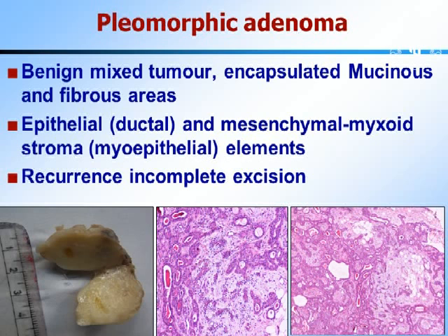So how do we diagnose a pleomorphic adenoma? The diagnosis starts at the grossing table. You can make out that they are pretty well circumscribed lesions and they've got a glistening appearance. And the glistening nature is because they have a component of the mesenchymal element. So they are also called mixed tumors. You can see very clearly they have the epithelial component, which is ductular, and then the mesenchymal component, which is caused by the myoepithelial component, and the cell of origin is the ductular cells. Even though they are benign tumors, they are known to recur, and they can even result in malignancy later on.